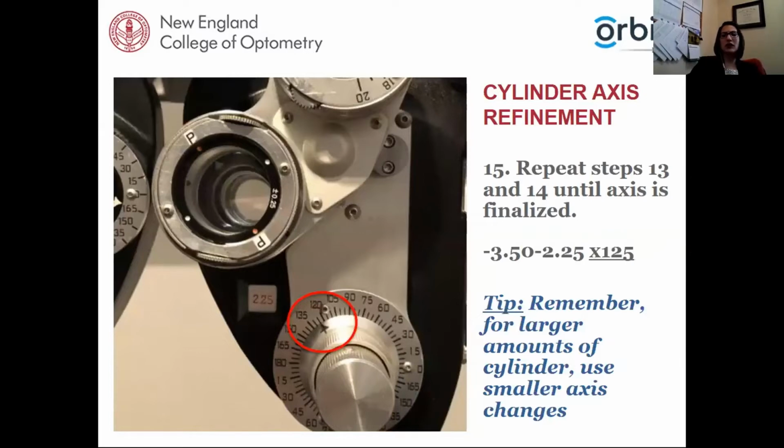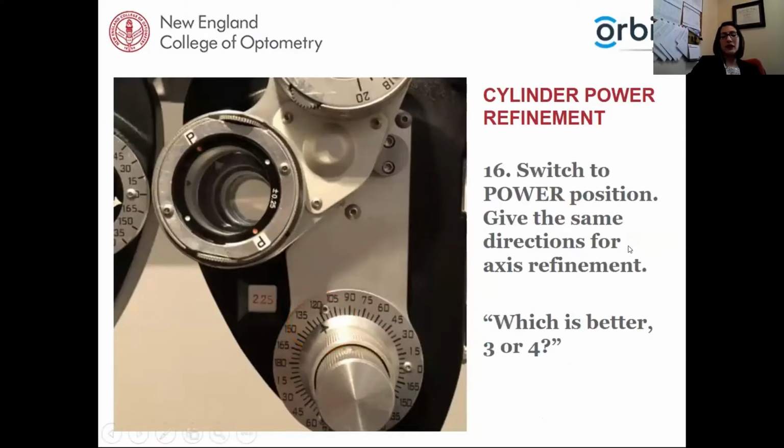And so in our case, we had initially started with an axis of 116. As we rotated counterclockwise, and then we needed to go maybe counterclockwise again, we ended up with an axis of 125. And so that was the axis refinement. Now we're ready to change the power.